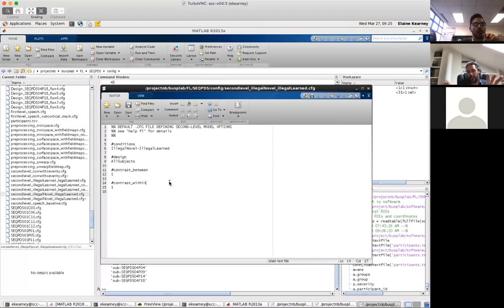And then, as you were saying, you want to look at that same thing separately for the two groups and do a comparison between the two groups to actually tell. Because when you look at the one group and then the other, there are going to be some differences between those results that are just spurious, and you want to know which of those differences are actually significant or not. So for that, you run something like a two-sample t-test where you compare the difference in novel versus learned in one group versus the other. Is that an accurate description of what you want to do?